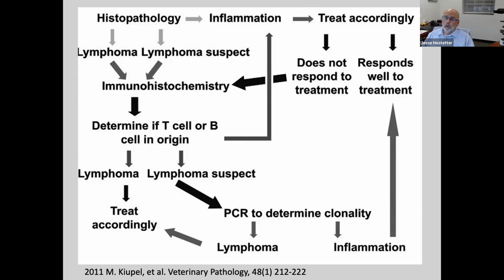I think that we know more about GIST now than we did before, and what we used to diagnose as smooth muscle cell tumors in the wall of the intestinal tract, many of those probably were GISTs. We did a smooth muscle actin, and now we have c-KIT. And I think there's another one too. Is it called DOG1? I think I learned about that in the last seminar I was in. DOG1 and c-KIT are pretty good at teasing out if it's a GIST, so we have these really good markers, and I think we're seeing more and more gastrointestinal stromal tumor. Hard to differentiate those on H&E.